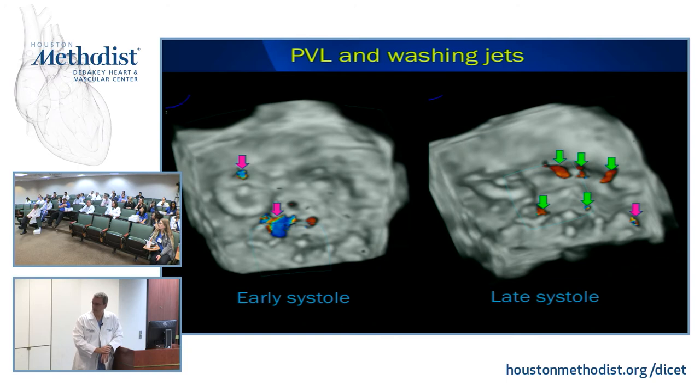At the end of the day, it's not too bad because the top is round and the bottom is round, but the neck is also nitinol, and it actually conforms to the shape. So it's smushy. You're right, though. I think eventually we'll put in oval-shaped things. The problem with oval, though, is that it looks good as it goes in like that. But if it ever turns 90 degrees on you after it's implanted, now it can obstruct the leaflets. So when it's a circle, no matter what it does, it's going to behave the same way. If it's not a circle, then a month later or 3 days later, if it shifts on you, that could be a problem.